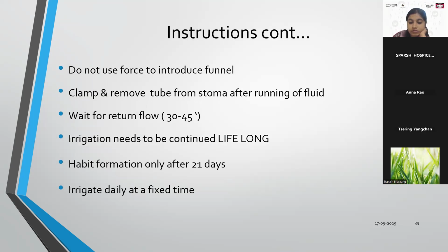When you are inserting the funnel into the stoma, it should not be forced inside. That is how one will come to know whether any kind of stenosis has taken place in the stoma. When the irrigation set is prepared, just like how we do in an enema, see to it that there are no bubbles.